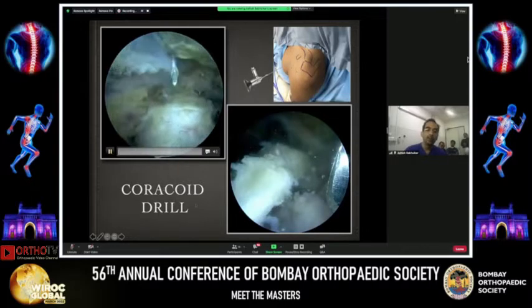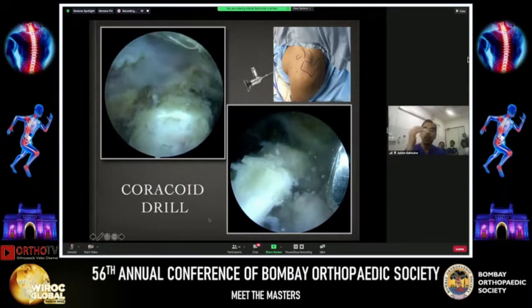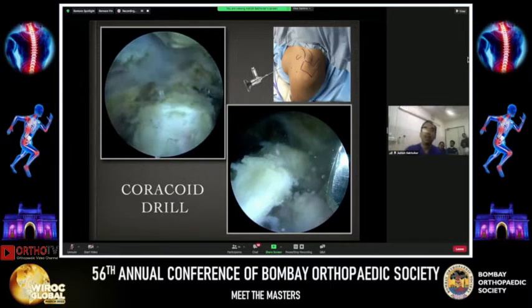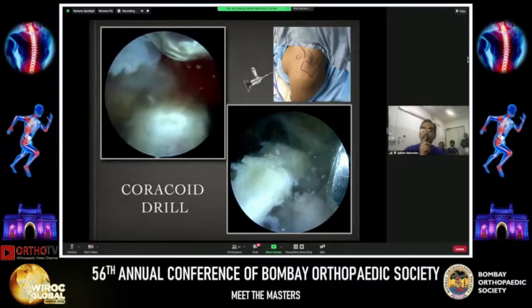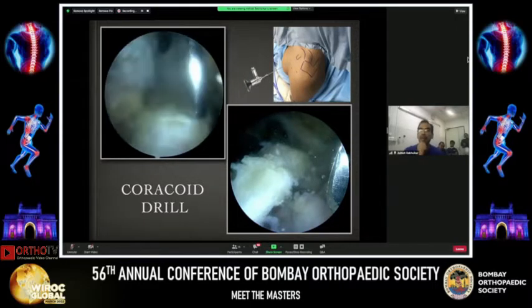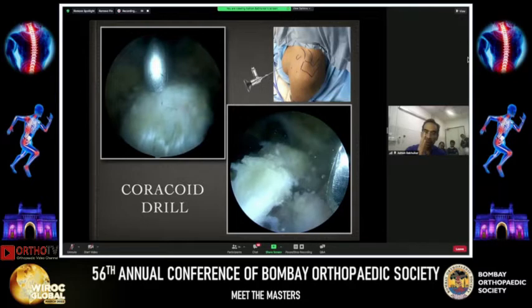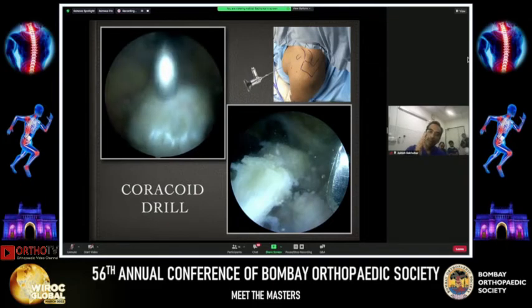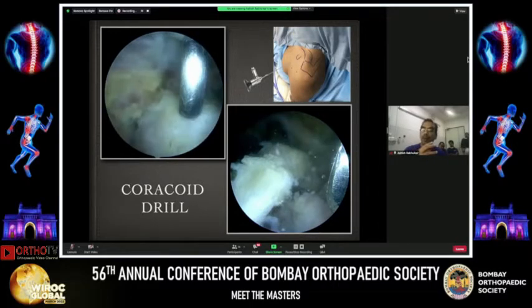Now coming to the coracoid drill: once you've done the split, you come back into the I portal, which is in line with the coracoid. Then you do the S-portal with the needle coming in from the top end, watching right underneath the coracoid. It is very important to align along the straight end of the coracoid, because the coracoid is in a three-dimensional twist and is not lying flat. Once you've got your needle and knife, note that the cephalic vein and its tributaries are very close near the S-portal and it will bleed. You bring in your alpha-beta guide, assessing where to position it — it has to be slightly slanted, and the anterior tip is critical because if you're too far anterior, there's going to be a blowout on the promontory.